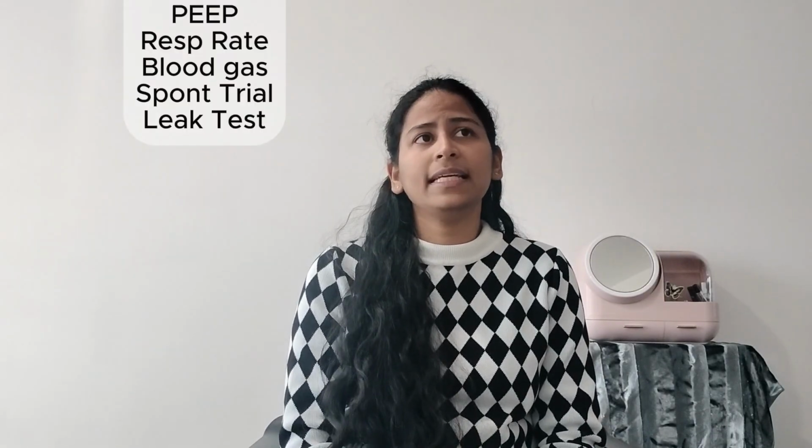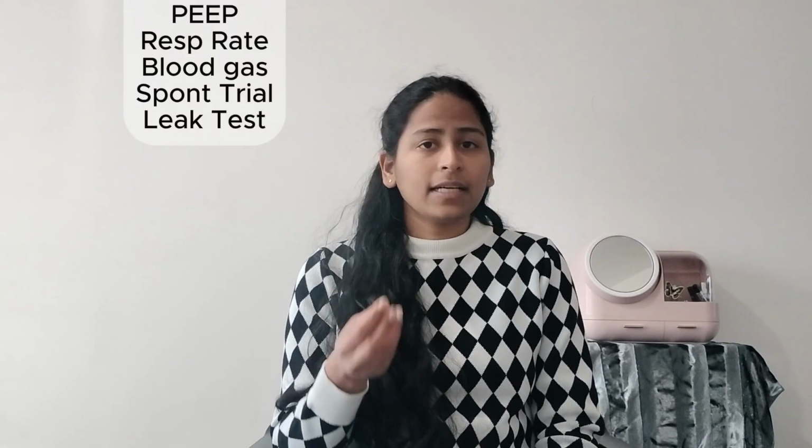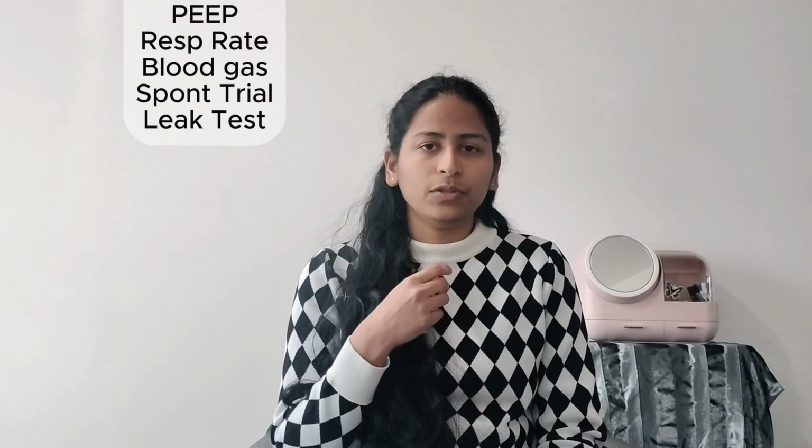And the other thing is to do a leak test. So leak test is where the cuff that is for the ET tube. So you would deflate the cuff and listen for any leak. Ideally you would want the air to leak when the cuff is deflated. So if you imagine the cuff, there's a tube in place, the ET tube, and there's a cuff which is inflating, and this is causing airtight seal, or ideally you would want a tight seal so that there's no leak from around the ET tube.